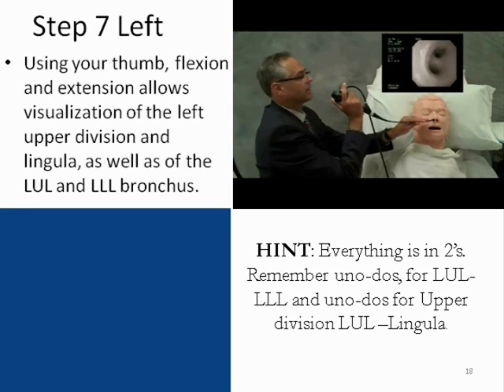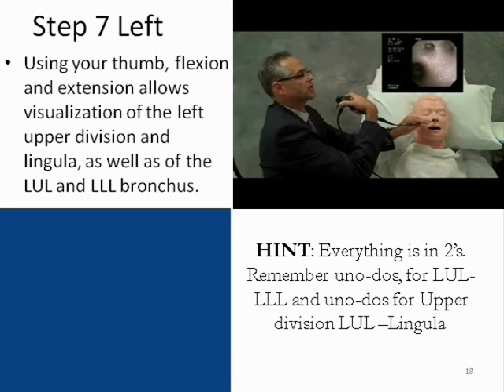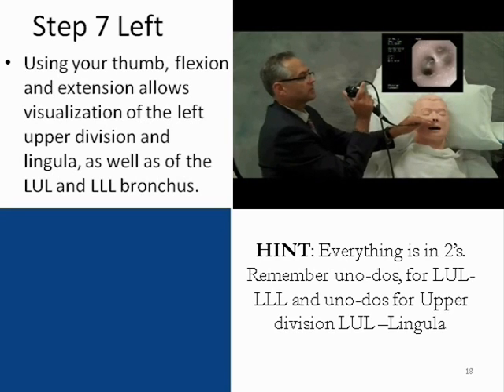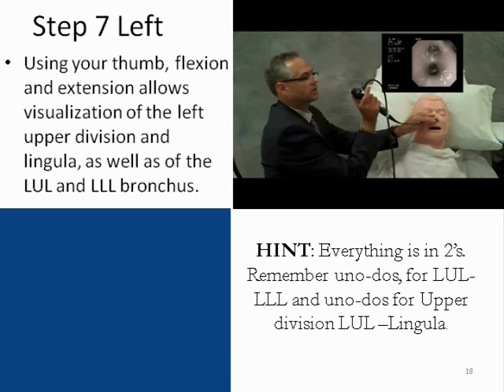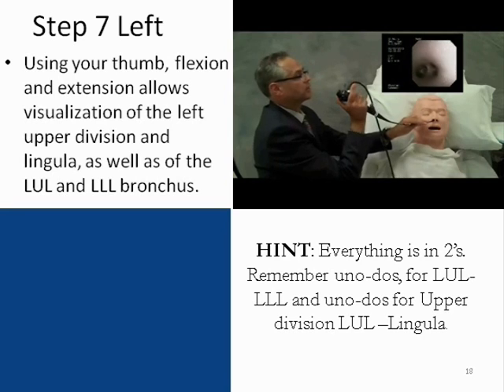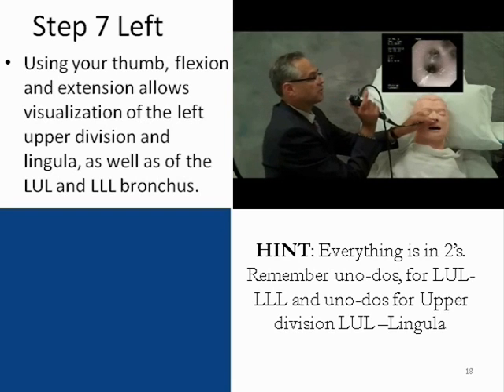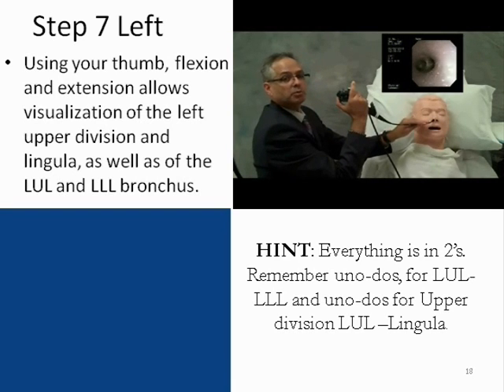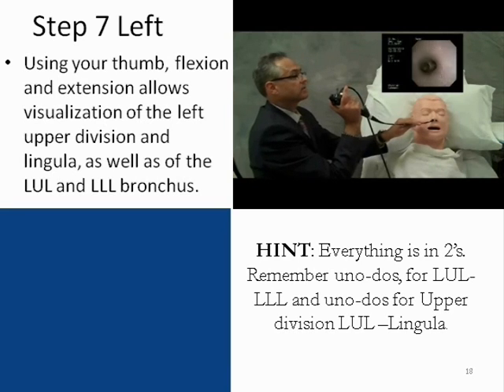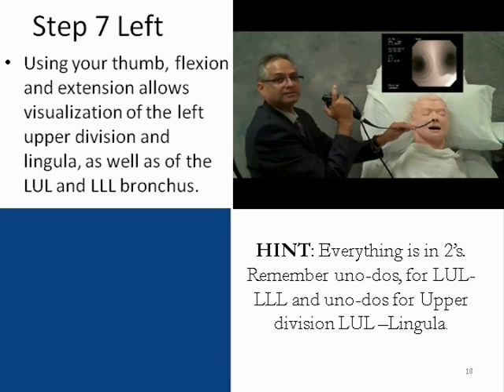Coming back to the midline, we enter the lower lobe bronchus, rotating the wrist sometimes to bring the scope into the superior segment posteriorly, and then rotating back to look at the basal pyramid. We are thus able to enter the posterior basal, the lateral basal, and the anterior basal. Notice how the scope moves forward and back. We'll review this further with the step 8 exercises. The scope is moved back up the left side to the midline above the carina.